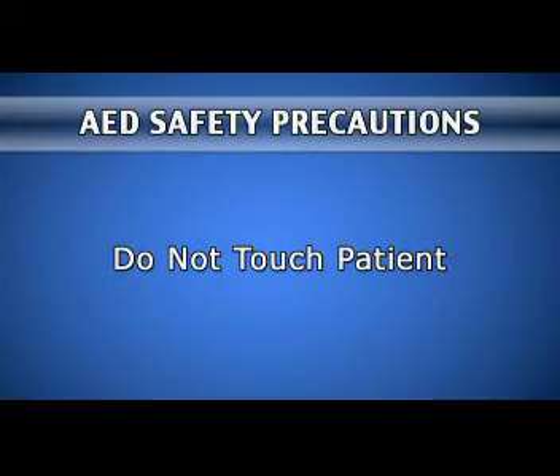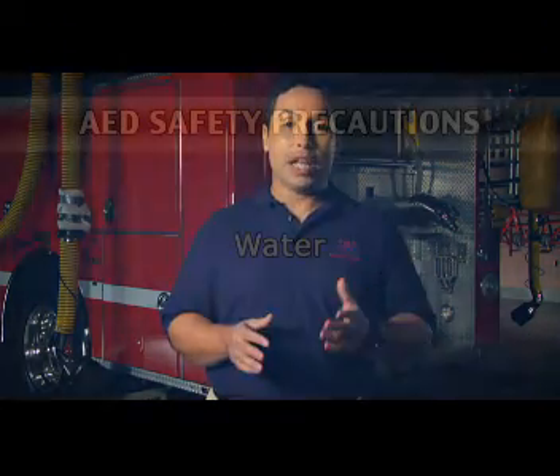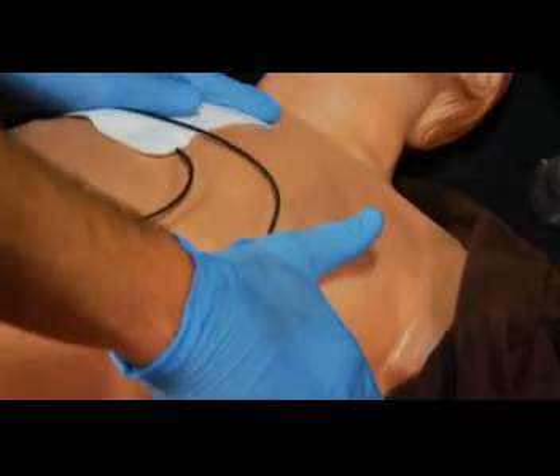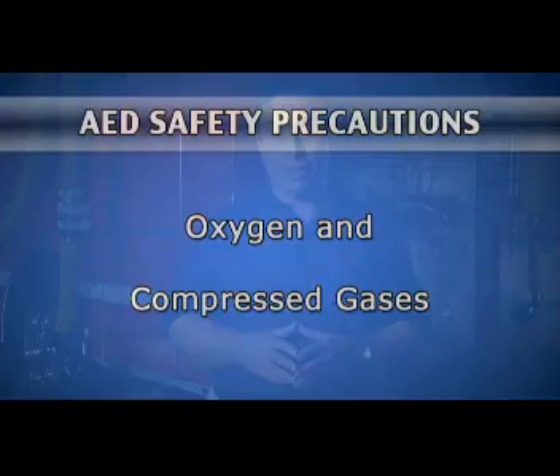You're almost ready to practice using the AED. First, we'll discuss some key safety precautions. When the AED is analyzing or shocking, do not touch the patient. You must stop CPR and clear the victim before analyzing or shocking. Make sure no one is touching the patient or their clothes. If the victim is lying in a puddle or pool of water, move them to a drier area before using the AED. Rain, snow, and small amounts of water are not a danger. However, water or excessive sweat on the chest can interfere with defibrillation and create a hazard for rescuers. Quickly dry the patient's chest before attaching the pads and press down firmly to ensure secure contact. If oxygen or compressed gases are present, turn off the oxygen or move the mask at least three feet away from the victim before defibrillating.